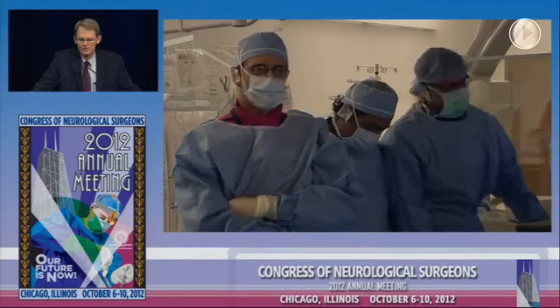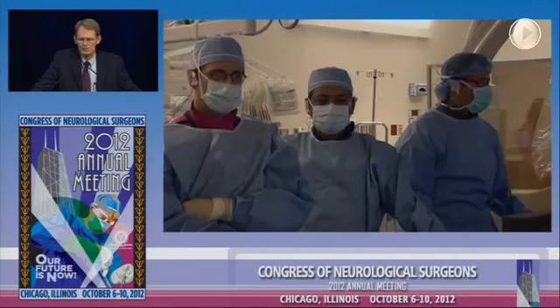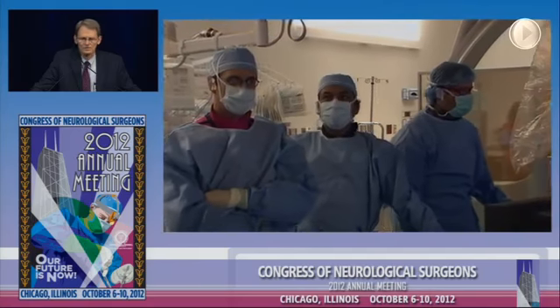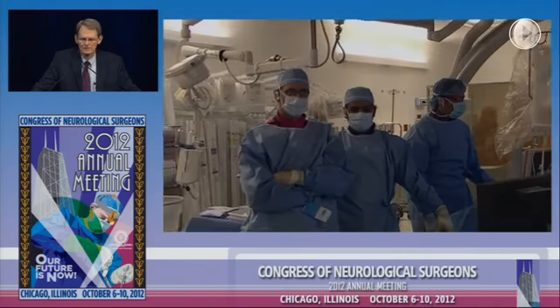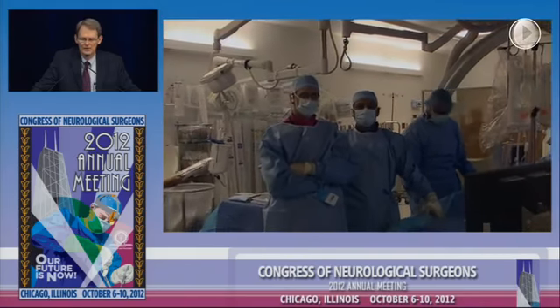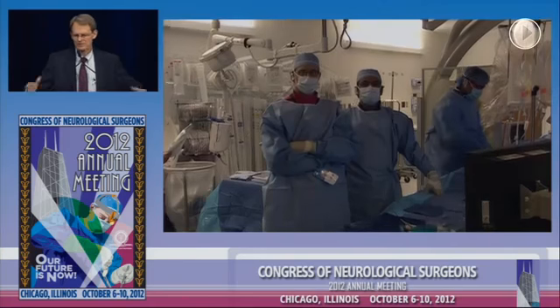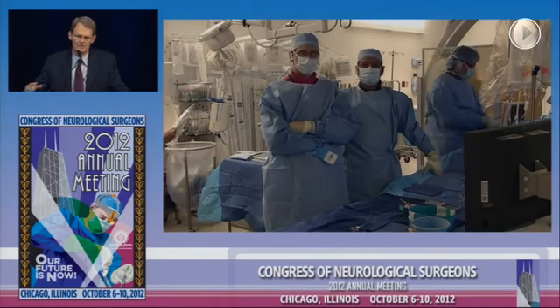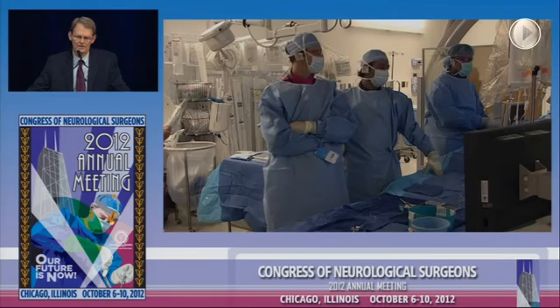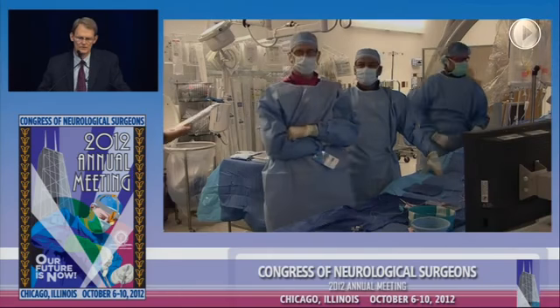And that's one of the things the company's done for us recently, they're now starting to make much, much longer stents. And that will, I think, be a big boon because when you start having to overlap these things, technically it gets more challenging. It is a little bit tricky to deliver them, as you saw, but that push-pull technique of pulling back and letting the stent come out and then nudging forward to expand it, not only expands it, but it also creates an area of increased density of the stent mesh at the neck of the aneurysm, and that's what we're looking for.